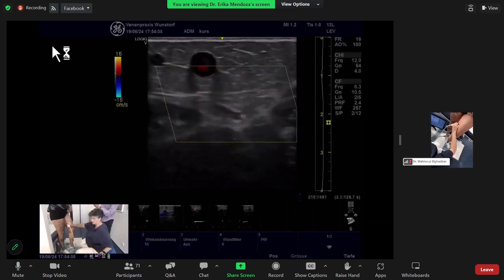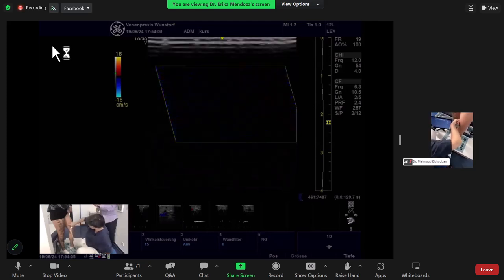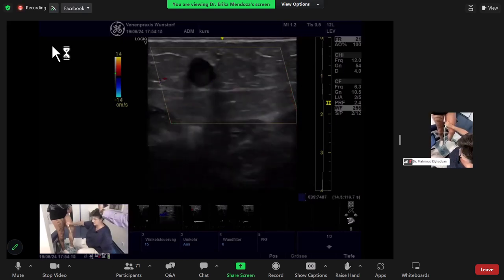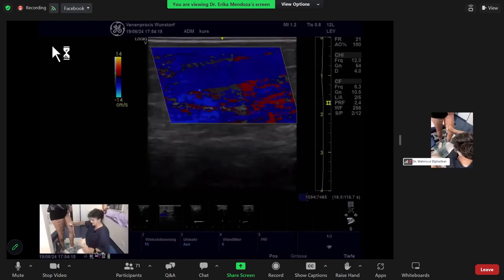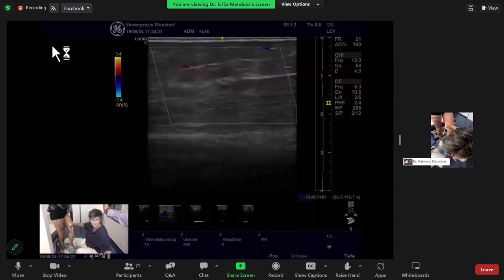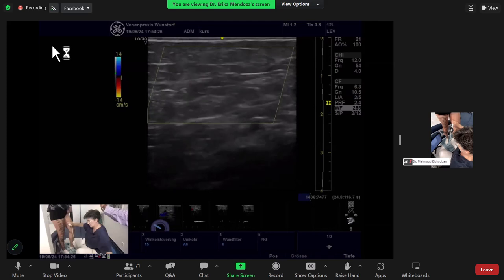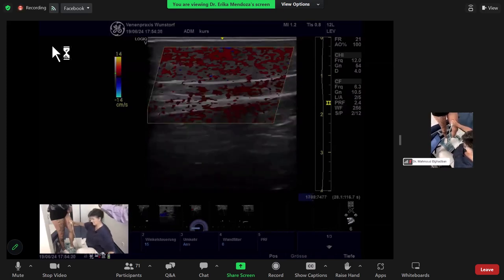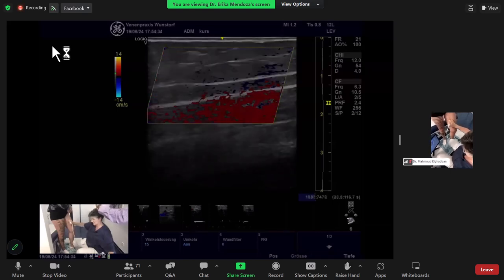It's so healthy that it doesn't talk to us. But again, I would close the tributary at this point of the inner thigh, where it comes out of the saphenous vein, because I will make an experiment with you to see if we can see it in ultrasound. If I close it a little bit further down, let's have a look. Here it is.